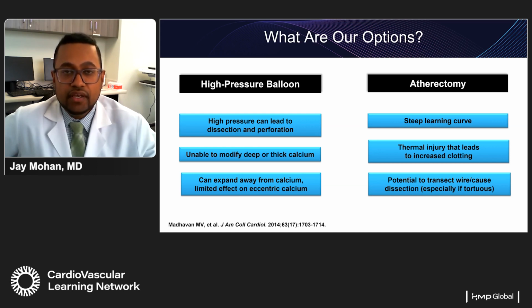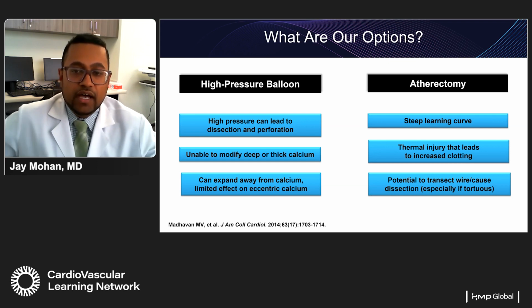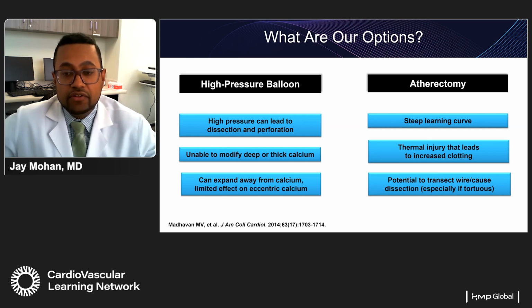And in the iliac system, unlike the common femoral, superficial femoral, and popliteal segments, we don't have atherectomy devices that can be safely used. Atherectomy devices inherently have a lot of risk, and that's why they've never been approved to be used in the iliac system.